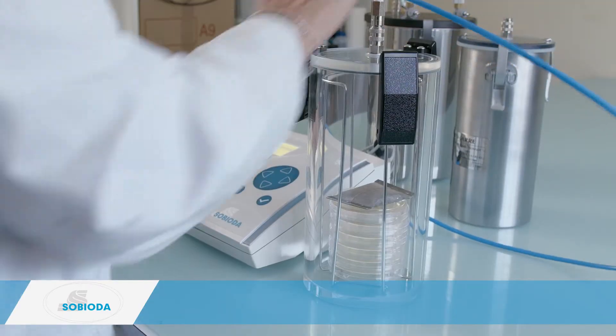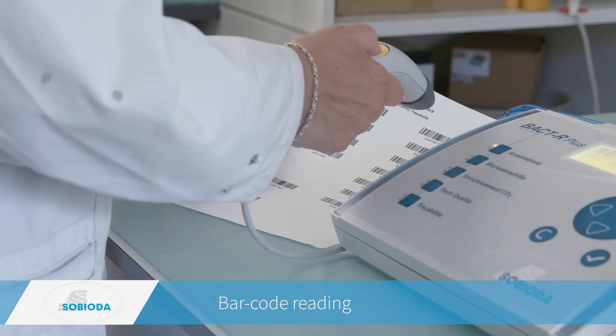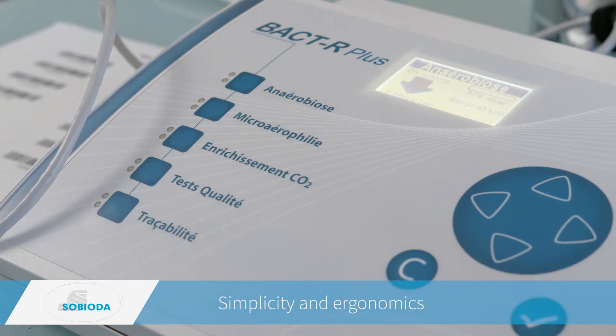Step one: connect the jar, then read the barcodes for the identification of the user and jars. Step two: launch the program.